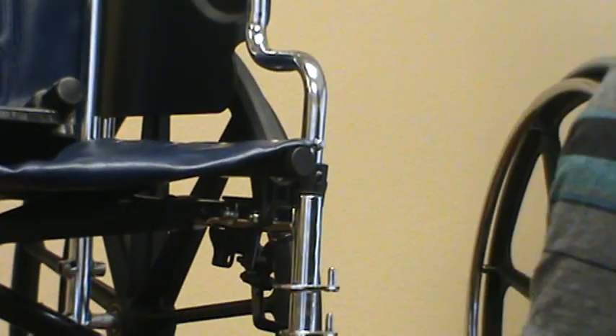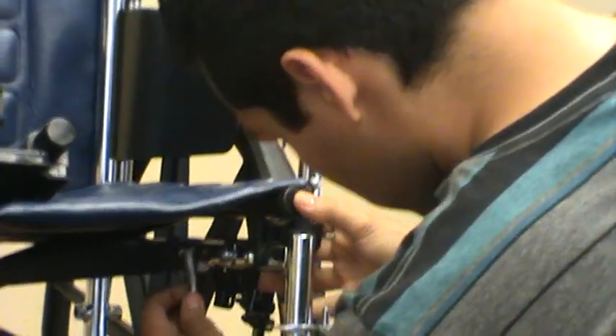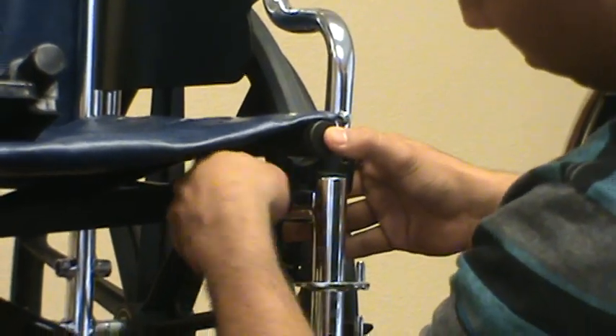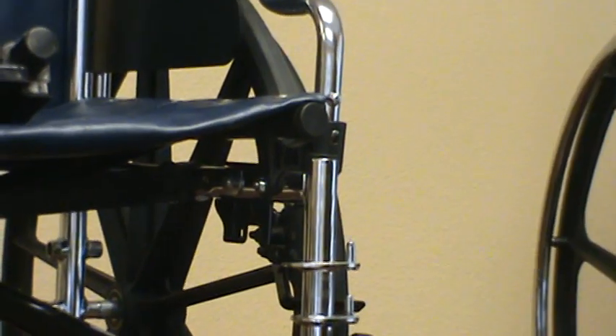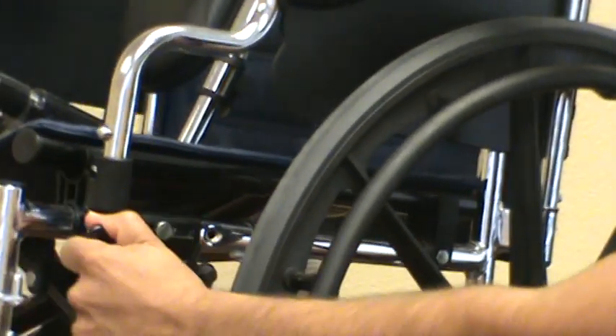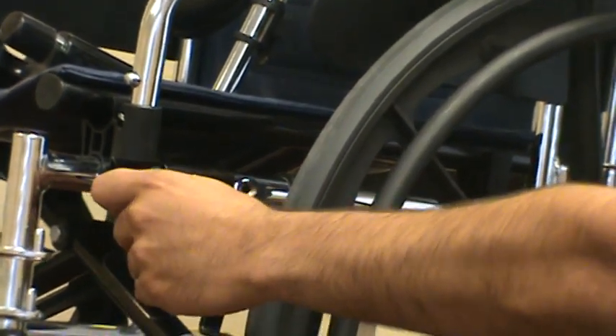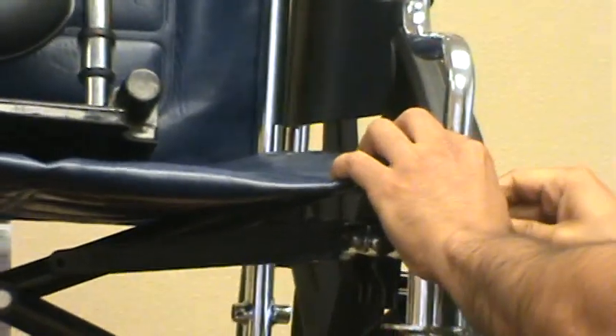Then go back and snug it up, tighten it, and try it. Push it forward to apply it — that wasn't too hard and it holds the wheel still, so that's adjusted right. If it was too hard to apply, you would loosen it back up and pull it forward one of your increments near the bolt, then try it again. It's a trial and error to get it right.